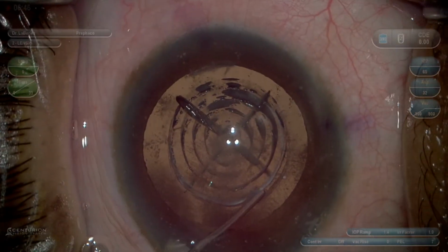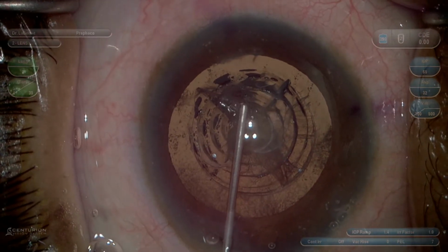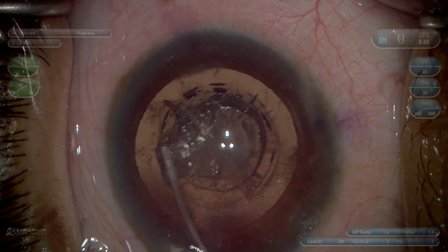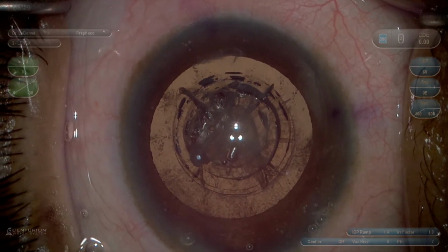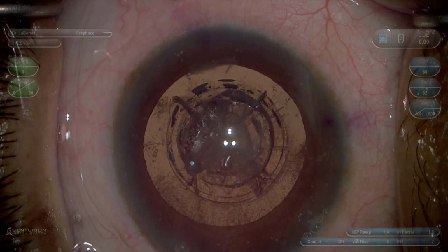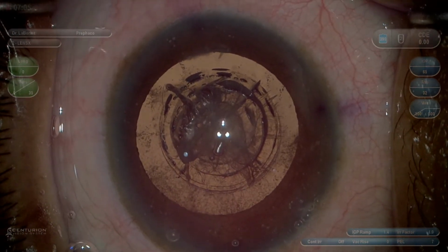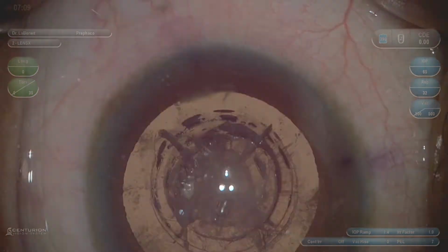So I filled the eye with viscoelastic, and then I like to scoop under the capsule, and as I pull I can see it's really somewhat stuck to the peripheral capsule. It's hard to distinguish cortex and capsule, so by going under it I can look for the stria of the capsule to know and distinguish the tissues. So now I'm very suspicious that there's a bridge, so I'll go in with the Utrata next.